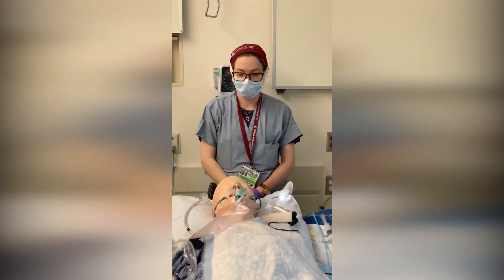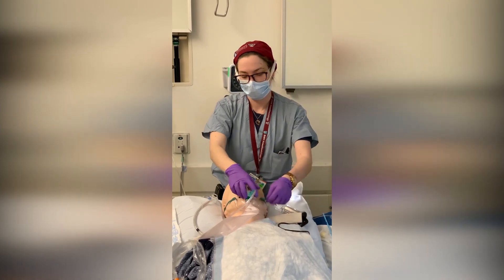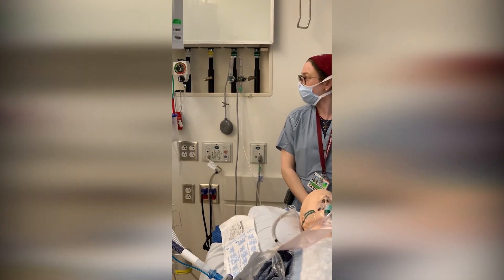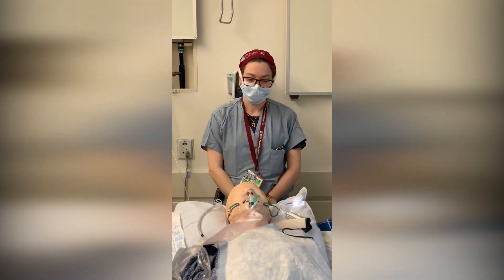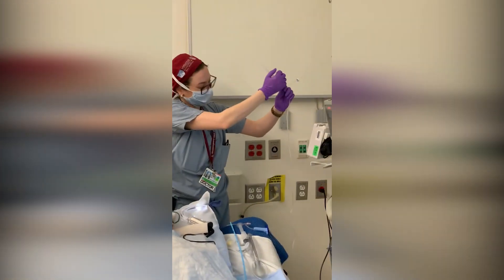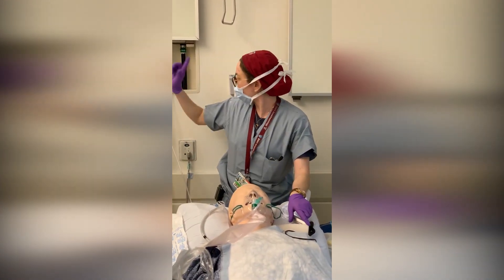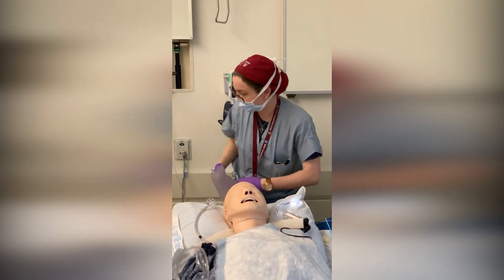Set the blood pressure cuff to cycle every minute and turn on volume for pulse oximetry. You will pre-oxygenate. If using a non-rebreather, make sure the straps are tightened and you have a snug fit before pre-oxygenating, and turn on your flows to 15 liters per minute. Once you have adequate pre-oxygenation, initiate your RSI, making sure you wait for the paralytic to take effect to avoid patient movement or coughing. When you are ready to remove the mask, turn off your flows before completely removing the mask from the patient's face.